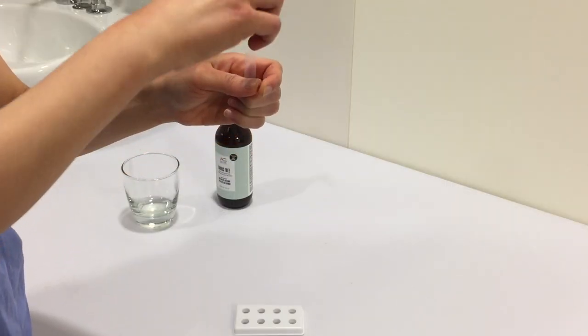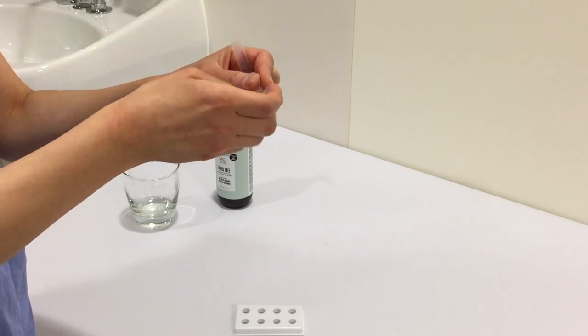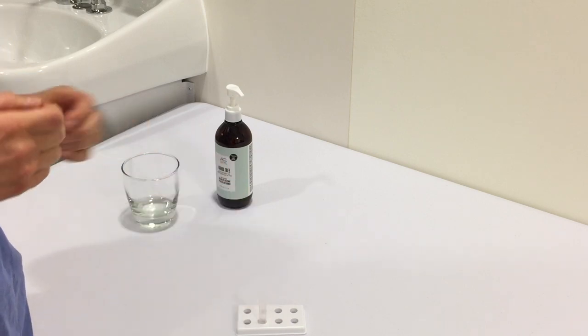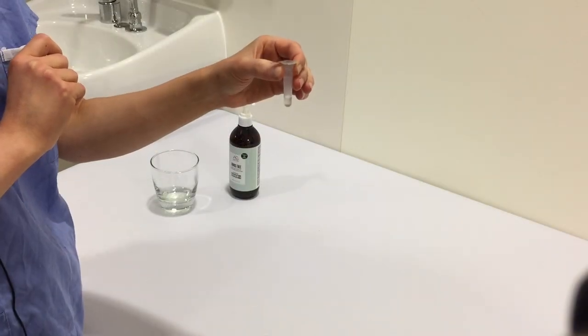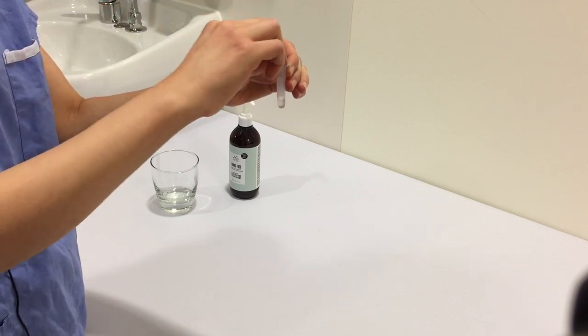You may need to squeeze the buffer liquid into the test tube and put it upright into a holder or cup. Some tests come with a buffer solution already in the necessary tube and you just need to peel off the top seal.